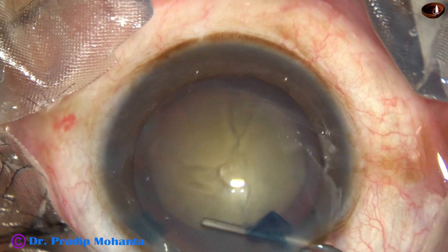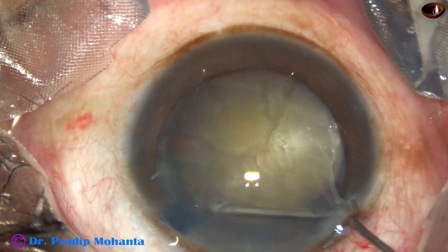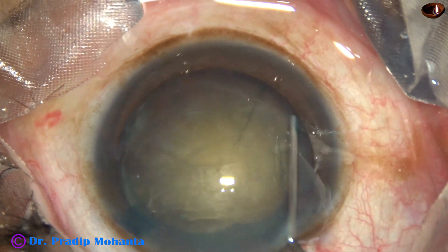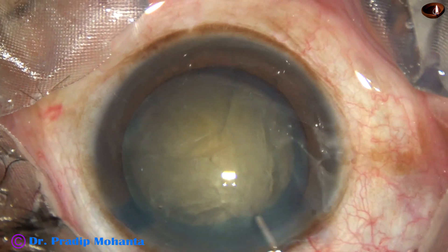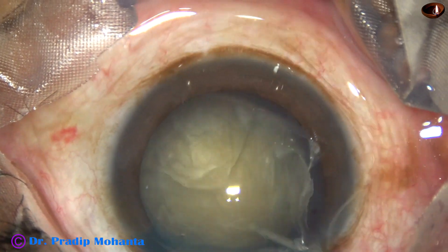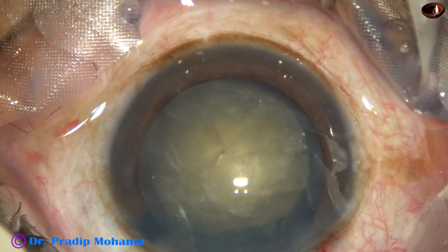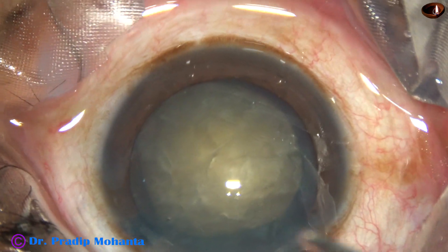You will have a lot of problems in managing the nucleus. There can be stress on zonules. There can be blowout and rupture of the posterior capsule. A lot of things can happen if the rhexis is small.